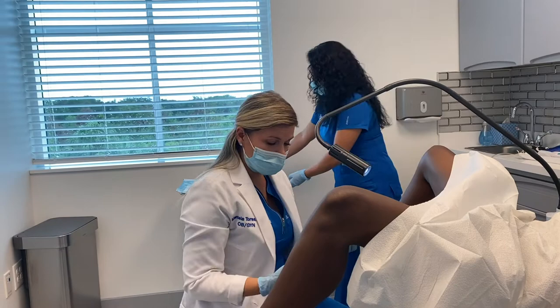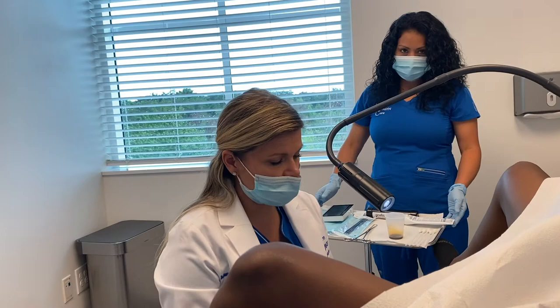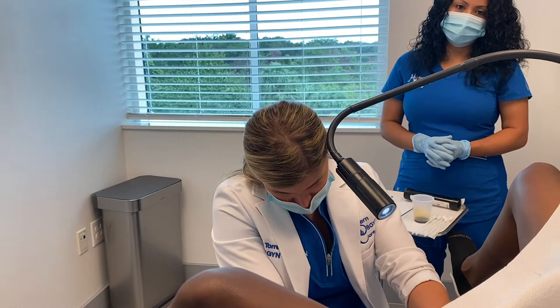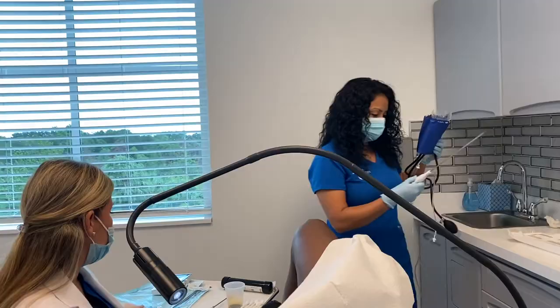We're gonna use betadine to clean the area and make sure that no infection gets into the uterine cavity. So what we do is we use a little bit of lidocaine and we use a needle extender. That should numb the area so that the actual procedure is less painful. We hold the cervix with a single tooth tenaculum. That is the best device to hold it. And then we gently try to see if we can fit the device without even having to dilate. Sometimes we can, sometimes we have to dilate the cervix.